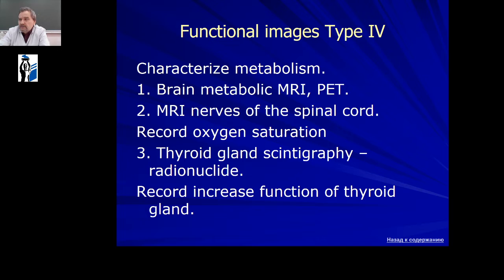And the fourth type of functional images of this concept characterizes metabolism. For example, brain metabolic MRI, magnetic resonance images, or positron emission tomography.